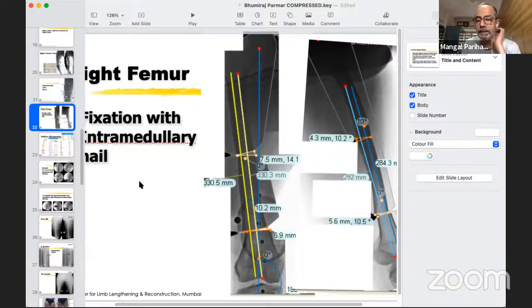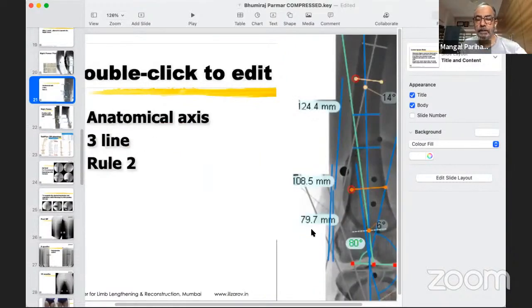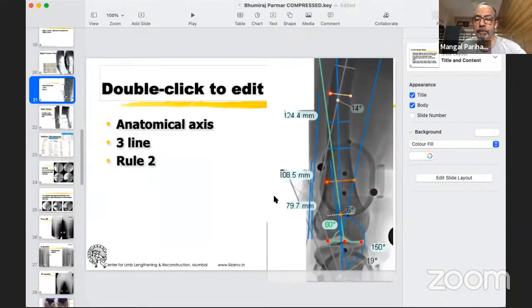Dr. Ahmad Barzenji says three things. Since we don't have long leg X-ray intraop, can we depend on anatomic axis and anatomic LDFA? Yes, Ahmad, this is what I just showed on that, using that protractor. We are using basically anatomic LDFA as the line for the direction for the initial wire.